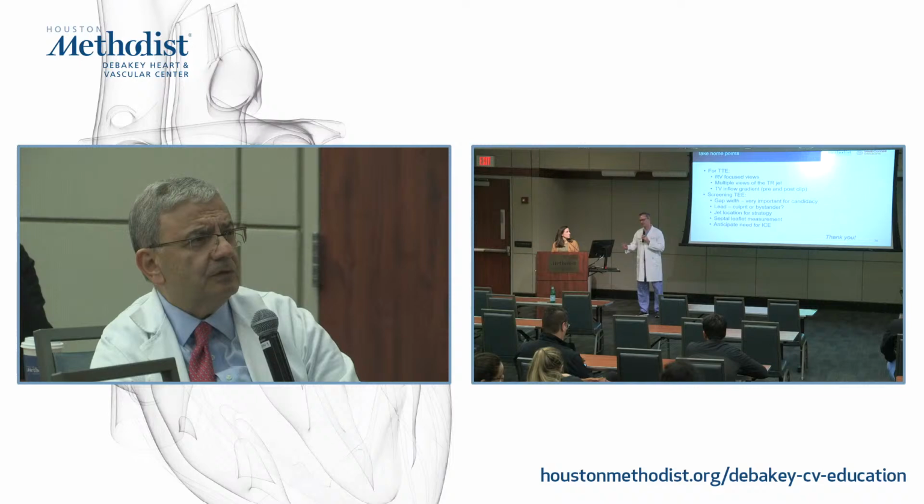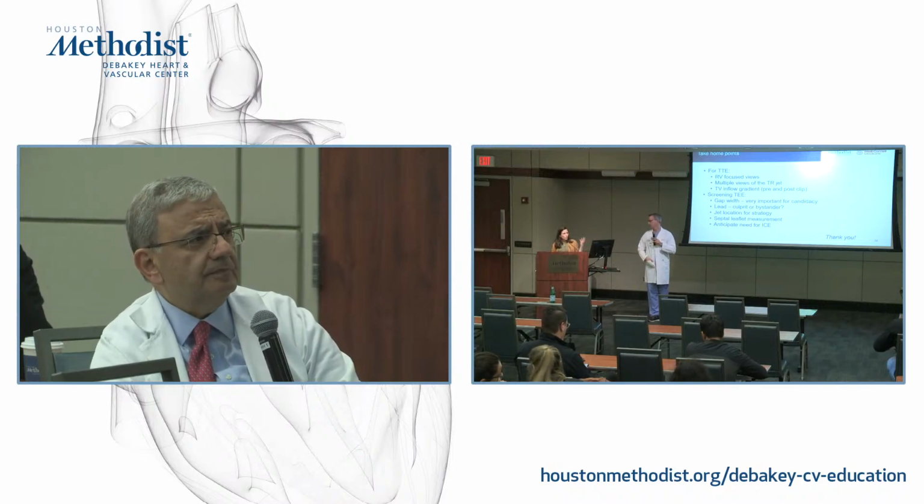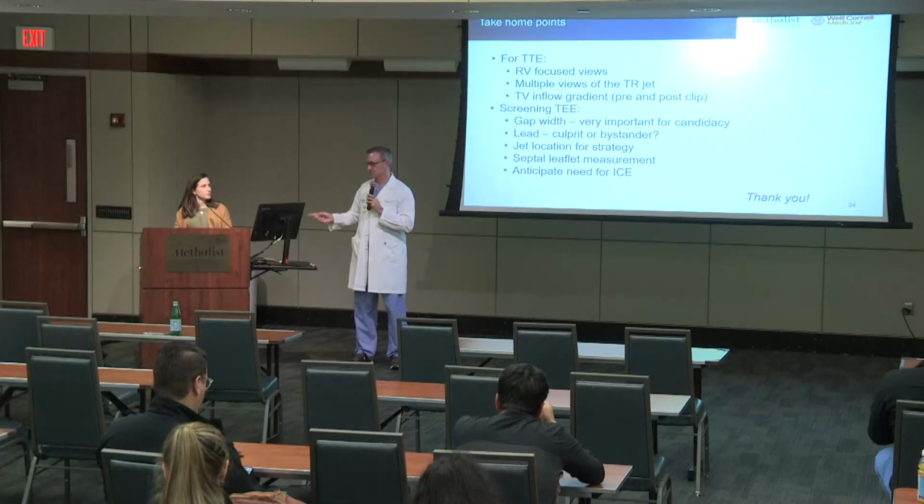Yeah, and then, no, we're thinking around percent-wise? 60%. And yeah, which makes sense because from the 4 cases that we showed today, I think we used ICE in only one or two. We anticipated we would need it on the case you showed.